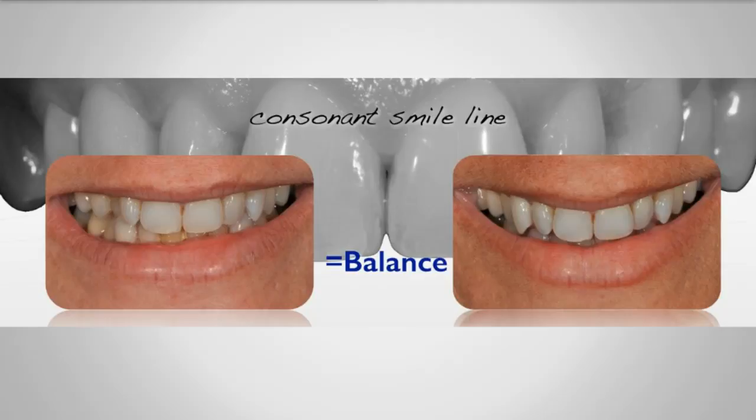Why extraction of the canine instead of ortho? Remember, this was a deciduous tooth that we extracted. It was failing. It was very mobile at this point. She waited till the last minute. So remember, this canine was a deciduous tooth. That's why we didn't treat that orthodontically. Could you use wax in place of the Teflon tape? I suppose so. It's really soft. I don't know that your composite resin might collapse over it. I've not tried it. You could give it a try.